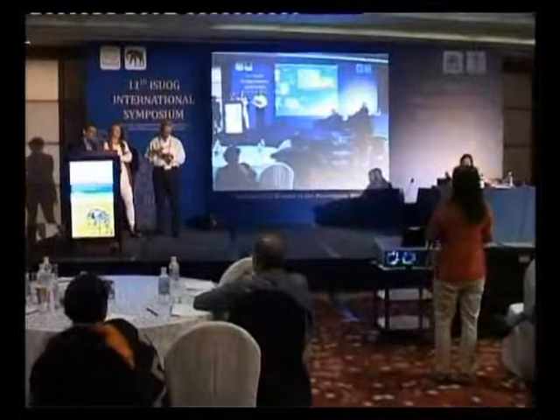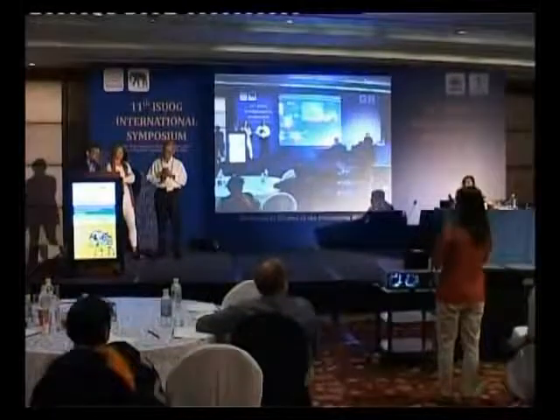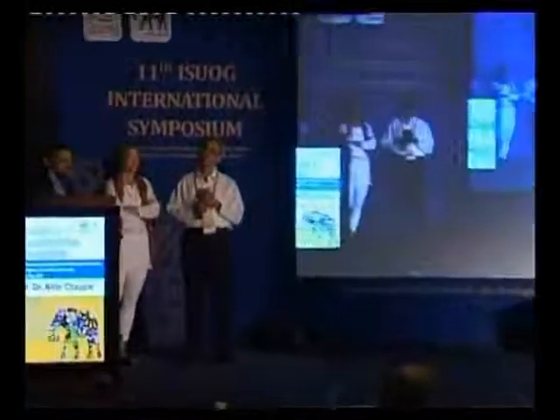This is just a comment on Dr. Praveen's presentation. I think the cutoff we keep is 4 millimeters for all postmenopausal women. Now we have realized that there are two different kinds of postmenopausal women. One, those who present with postmenopausal bleeding, and the other ones who are asymptomatic and just had a higher thickness of endometrium. So they are totally different.